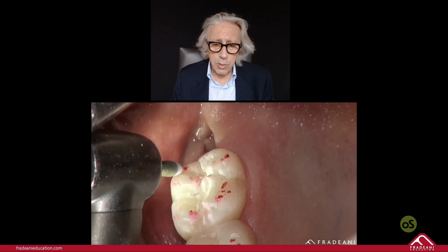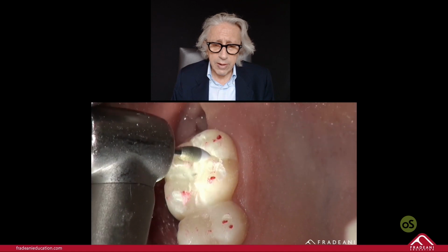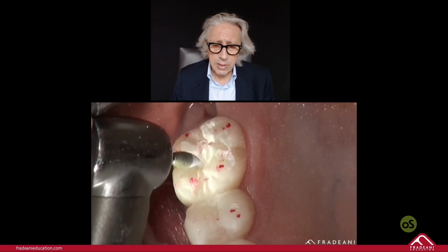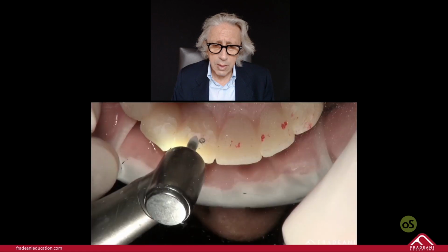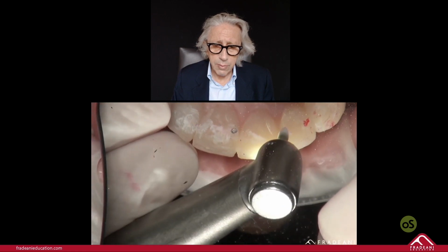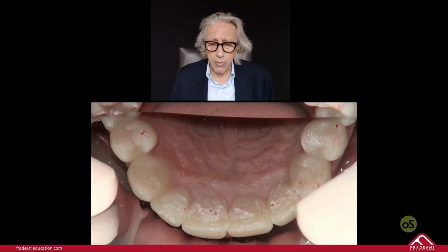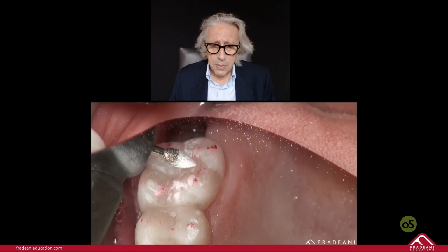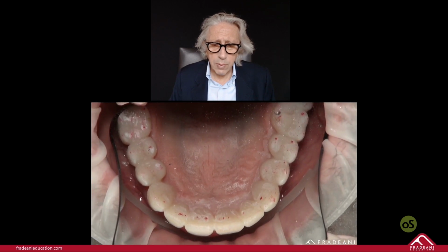We try to grind the proper way to leave it just on the vertex of the cusp, the contact, and to have the chance to optimize the contact everywhere, so that the Artus foil is caught by the occlusion. Artus foil is just 6 microns. We still optimize 100%. We want to be perfect.